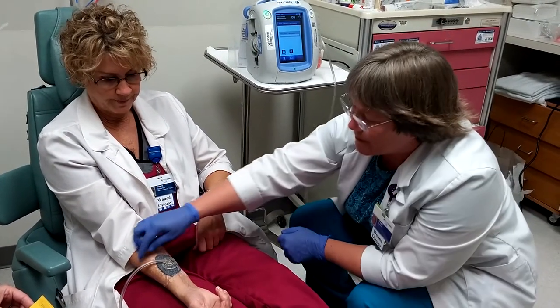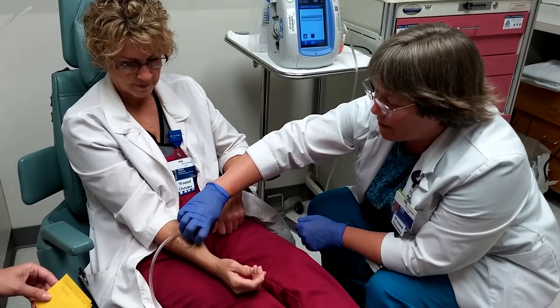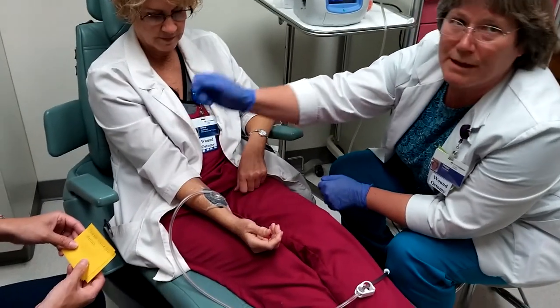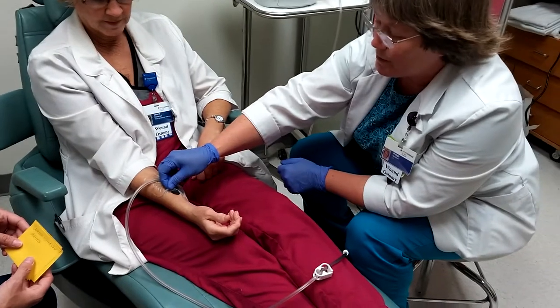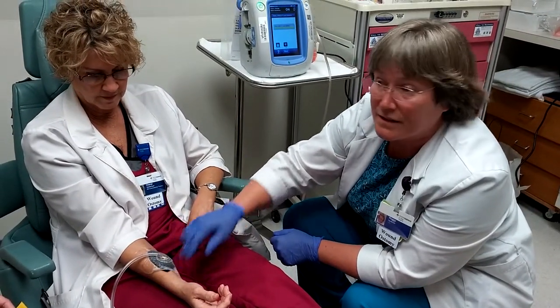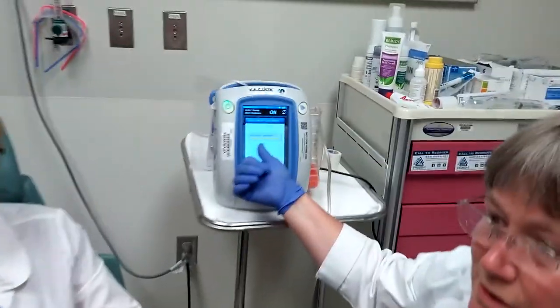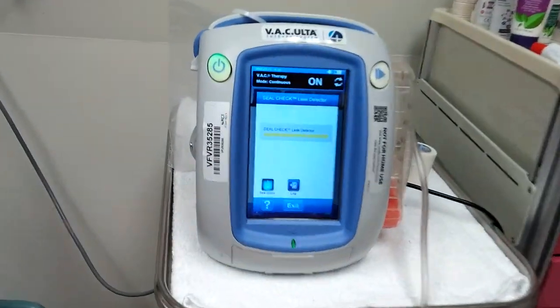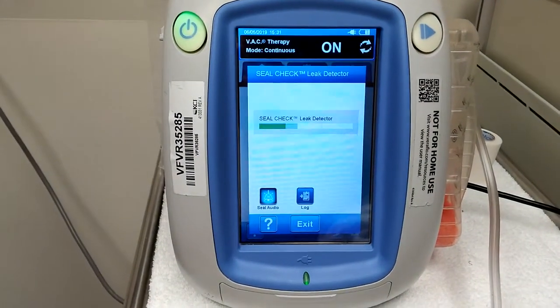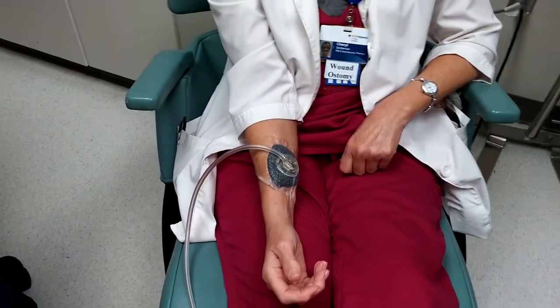Another alarm is if, for instance, you got up and stepped on something, or the drape peeled back, or it's a moist area and it's leaking — so there's an air leak. You can see on the canister that there's a problem there. You might try to fix it, but it's not going to completely stay, so you'll need to patch it.